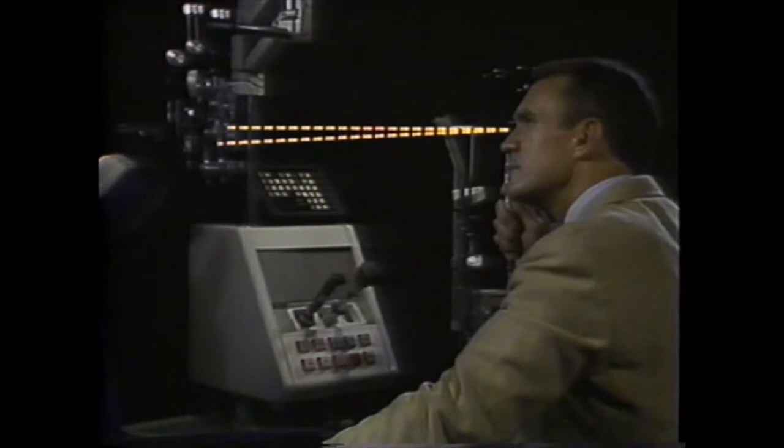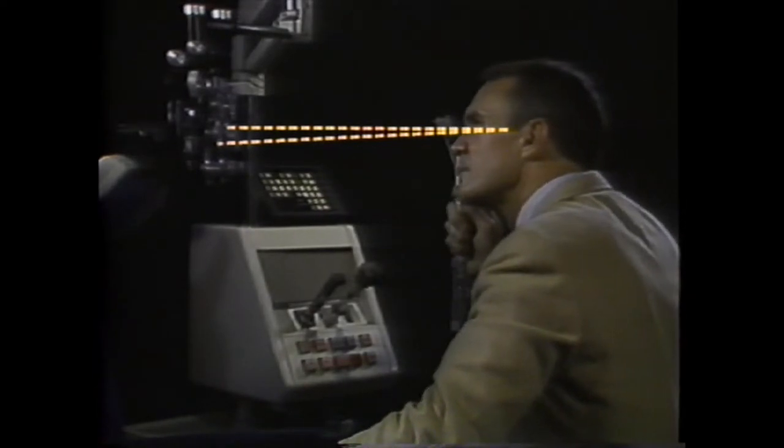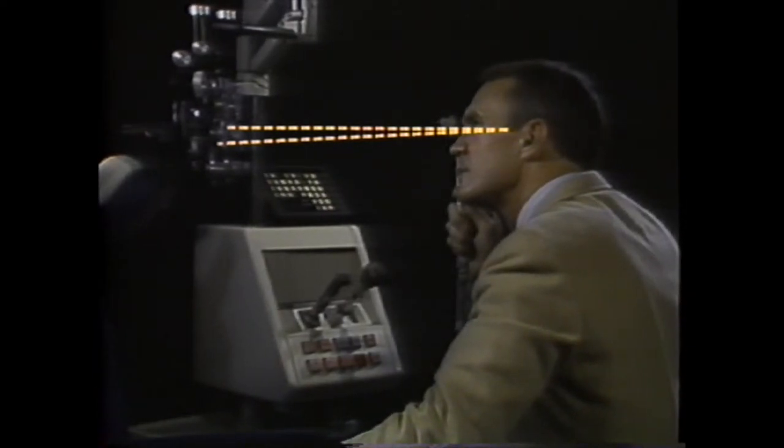If you move forward inside the far point, the far point now falls beyond the retinoscope and you will pick up with movement. The farther forward you move, the more pronounced the with movement becomes.